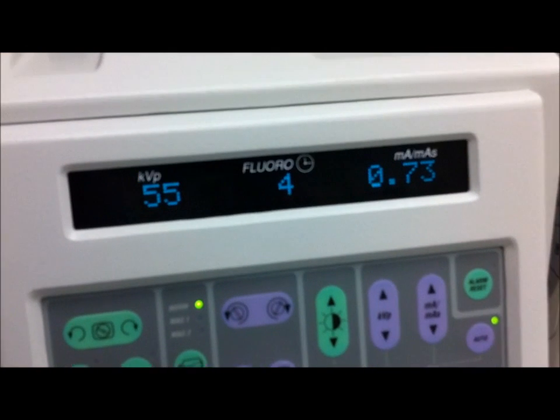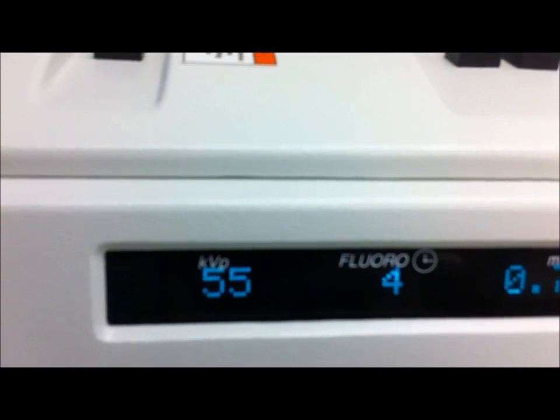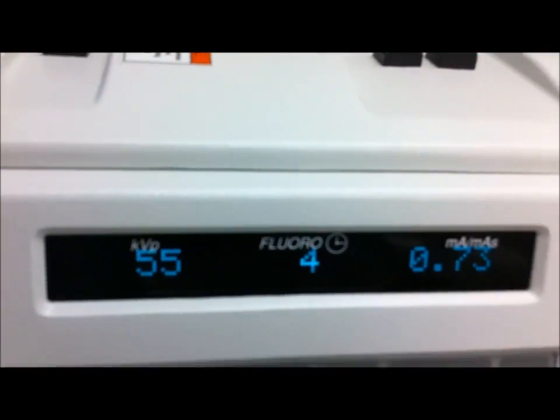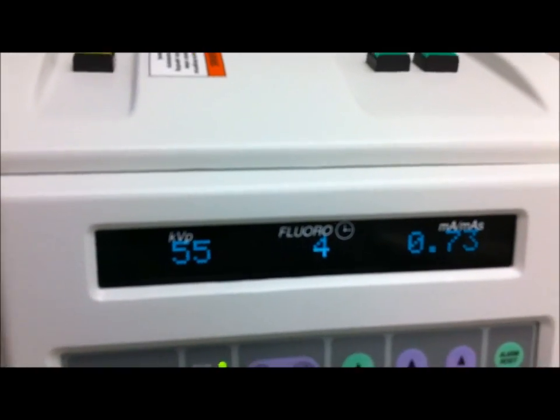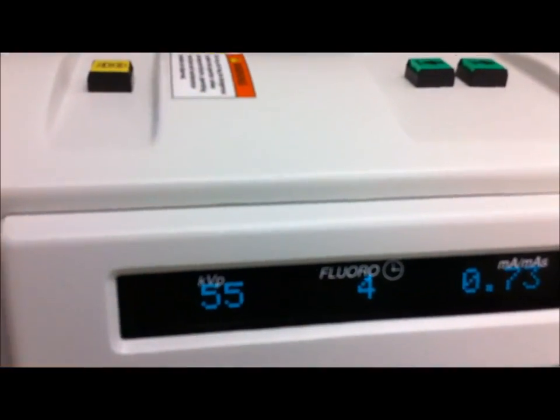And when you actually run pulse on this particular C-arm, the fluoro time will reflect that. So if you hold it down for one second, it would take at least two, maybe three seconds before it even indicates one second. So it's calculating, factoring that eight pulses per second, and it'll calculate that into the fluoro time, which is very handy.